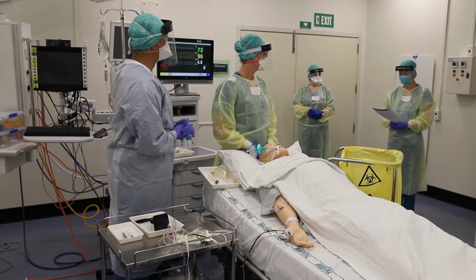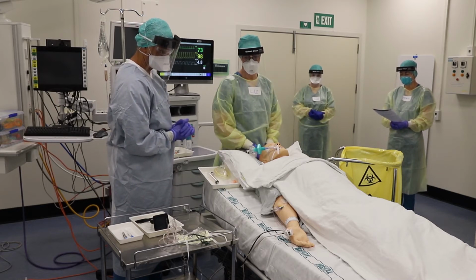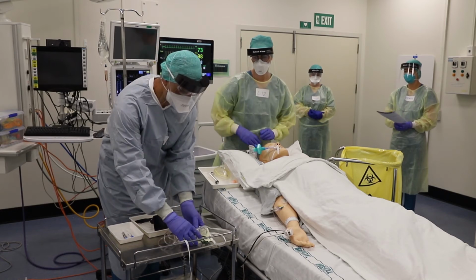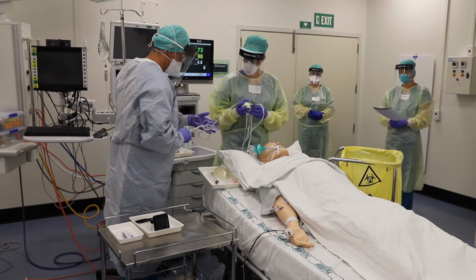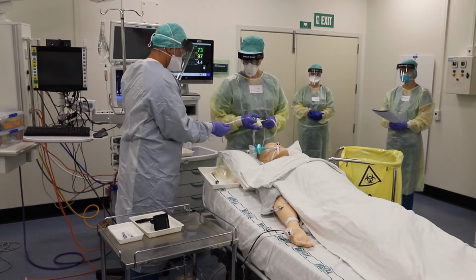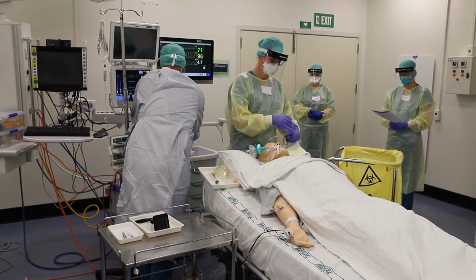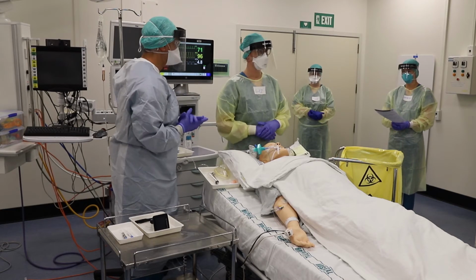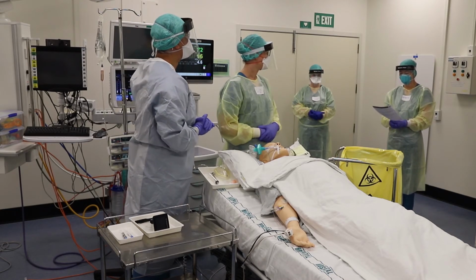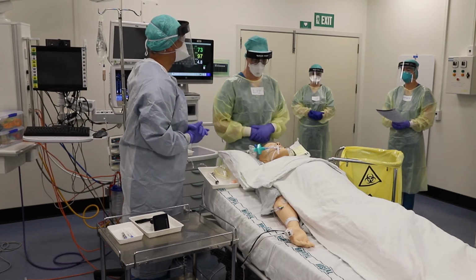Place the surgical and Hudson mask on left of patient and connect Hudson mask to oxygen supply, but do not turn on. I'll pass it to you. Thank you. I might have done that earlier. Okay. Connected but not turned on. Suction airway if required. Resheath the Yankauer and place under pillow.